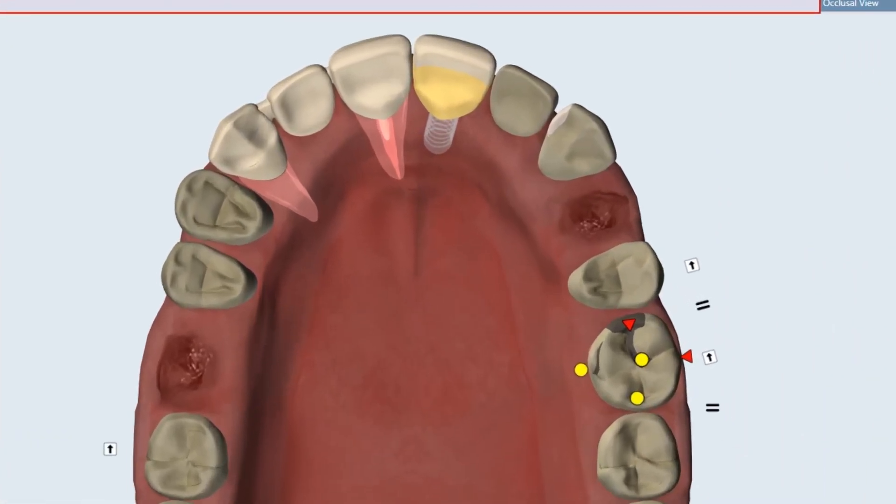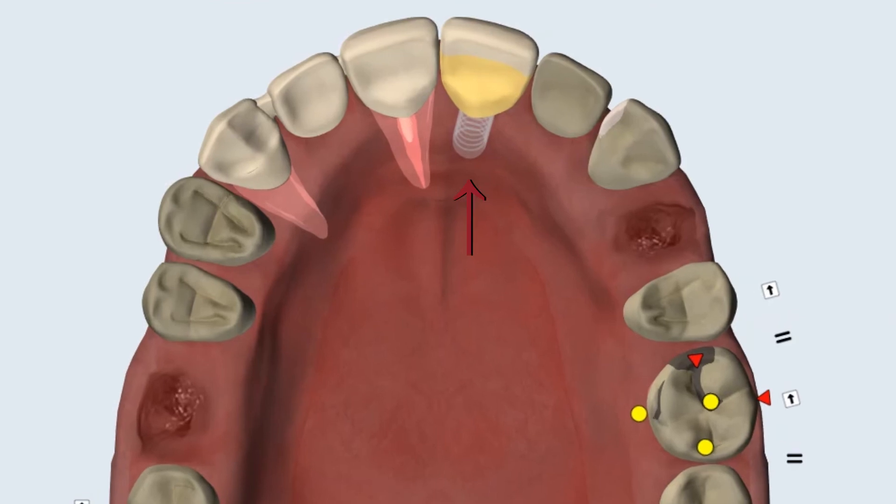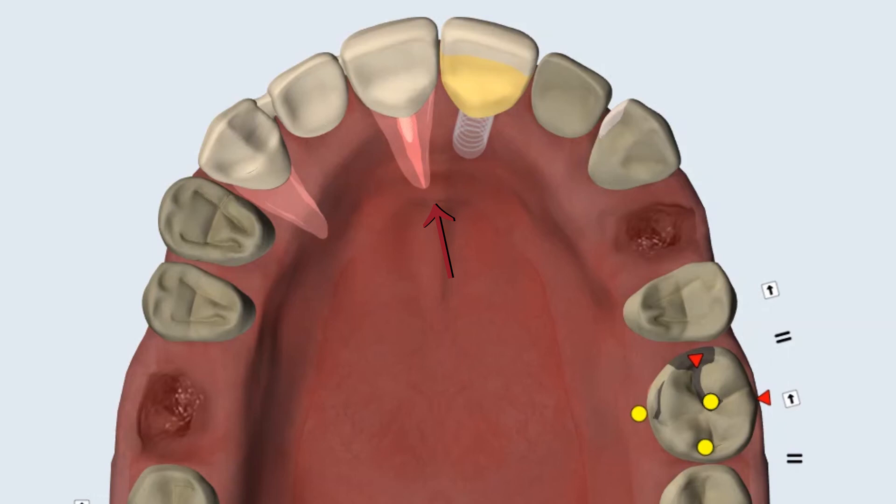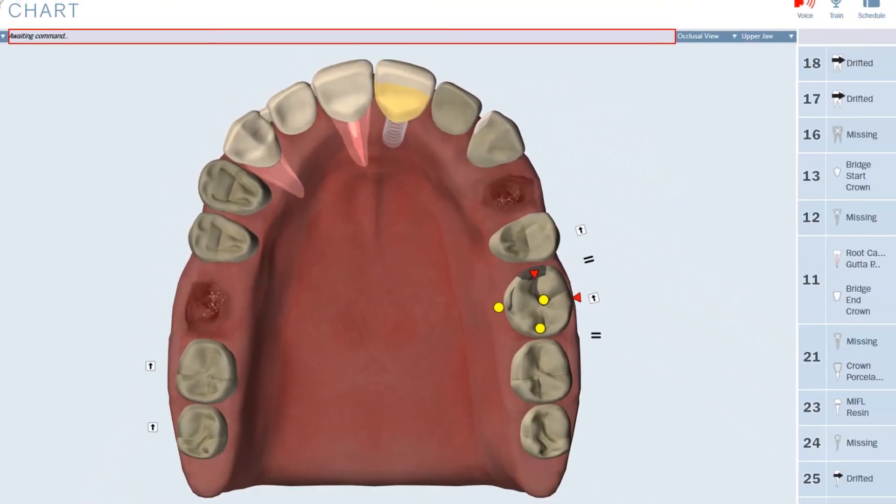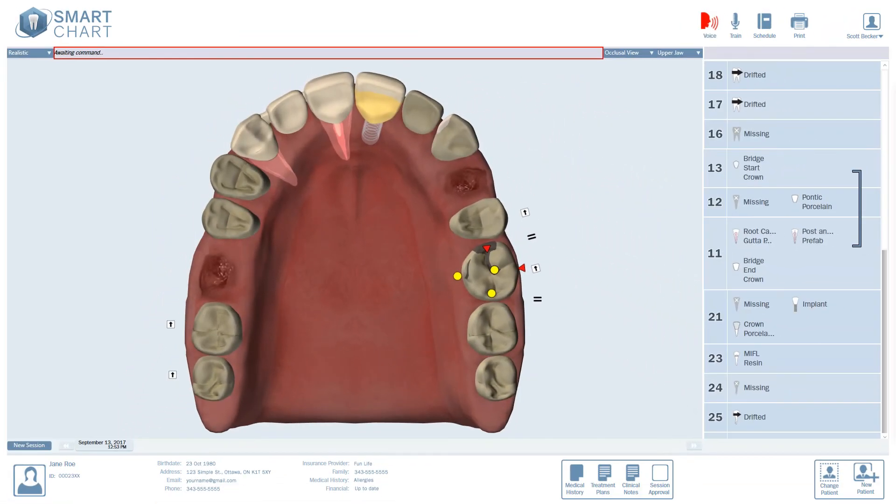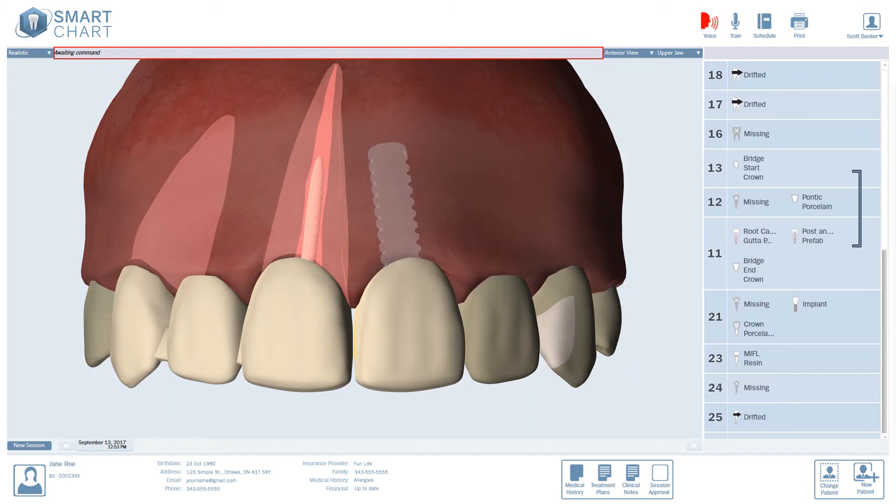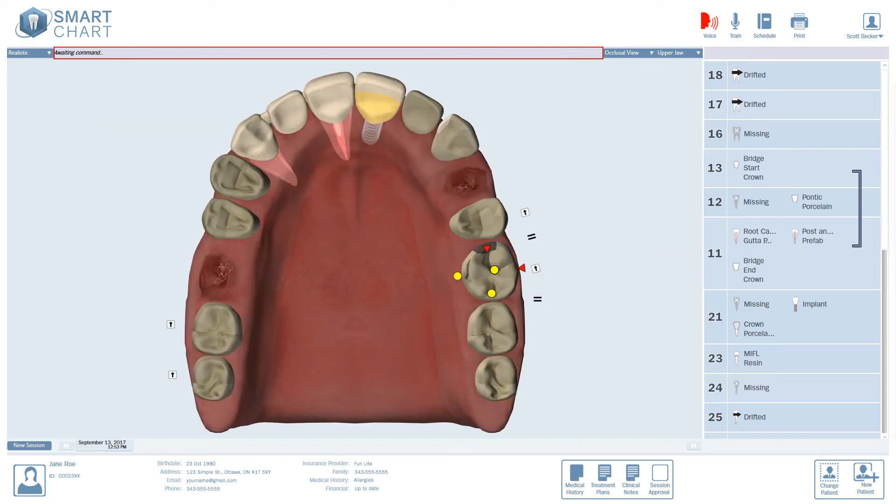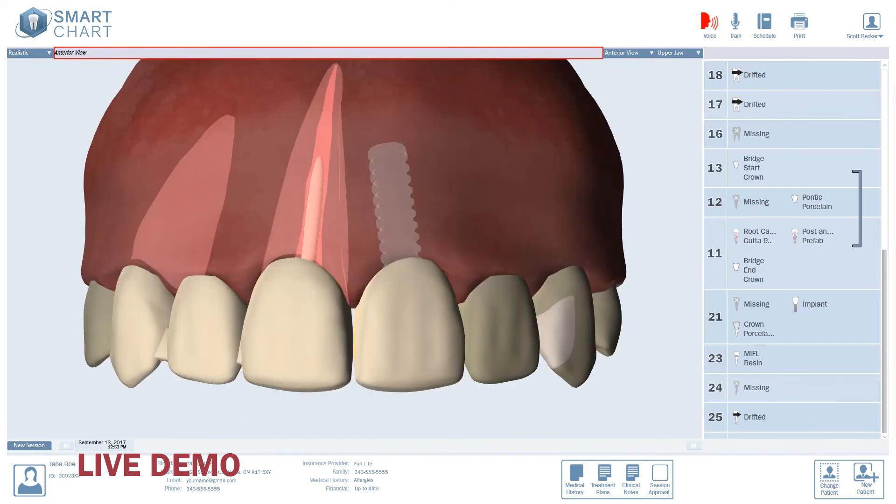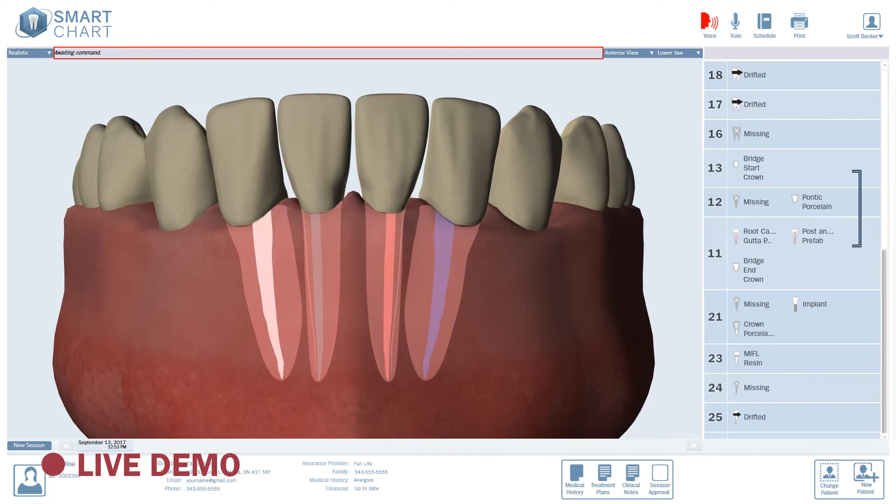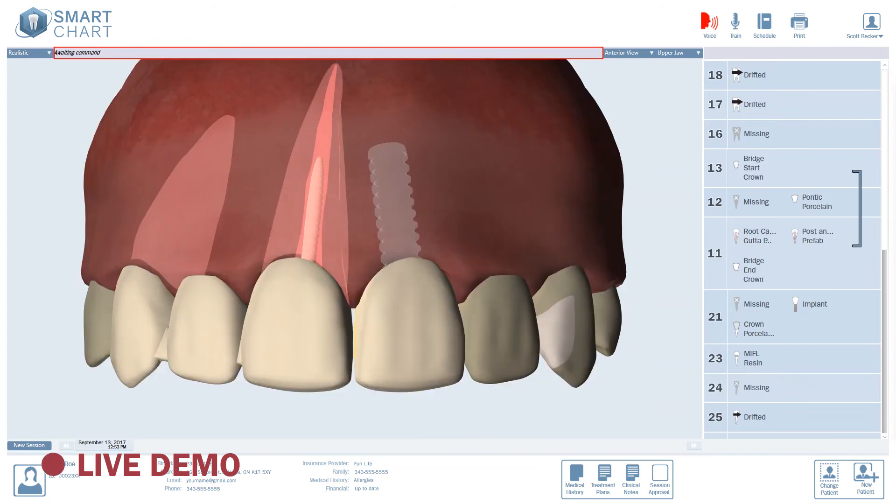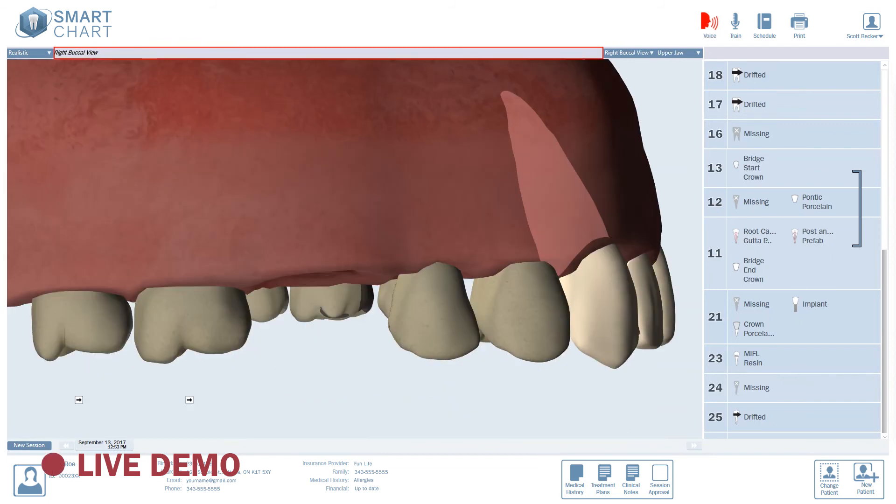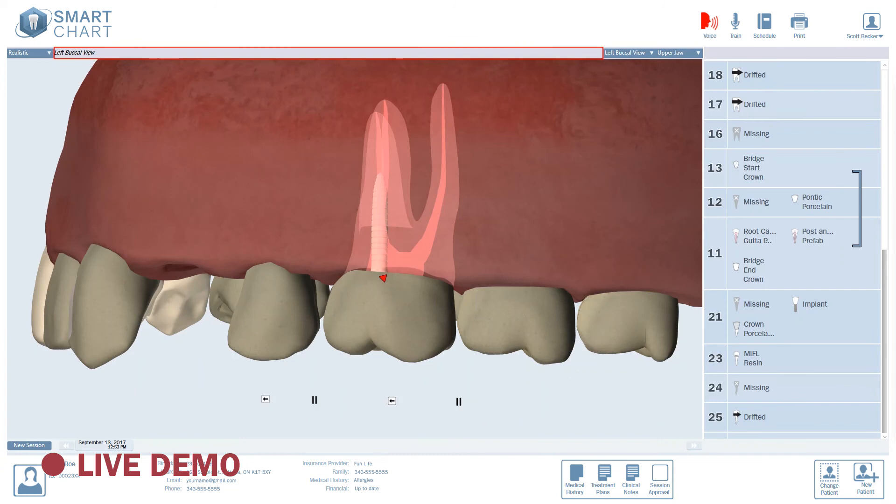In this occlusal view, you can see the implant crown on 2-1, both bridge abutments on 1-1 and 1-3, no root under the 1-2 pontic, as well as the endo and post and core on 1-1. In an anterior view, you can see all the same things from the anterior perspective. And you can switch views with a single command. Starting with the occlusal view, we can move to the anterior view, lower jaw, upper jaw, right buccal view, left buccal view, and back to the occlusal view.